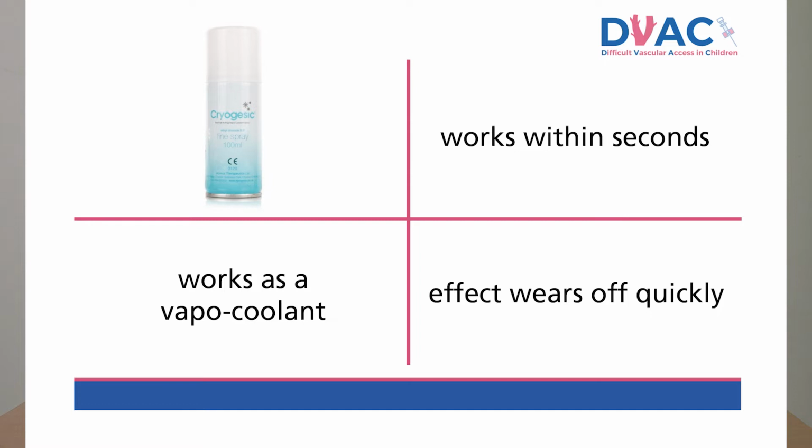It has no actual anaesthetic properties but works as a vapocoolant, so when it's sprayed onto the skin, it makes the skin cold and less sensitive as the liquid evaporates. This works within seconds, but the effect wears off really quickly as the skin warms up again after a minute or two.